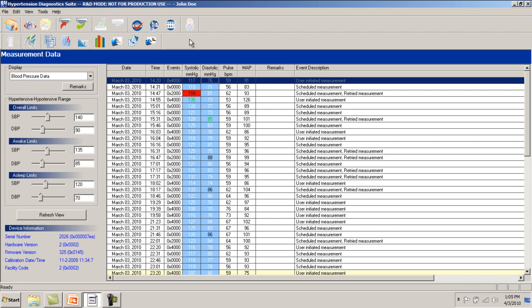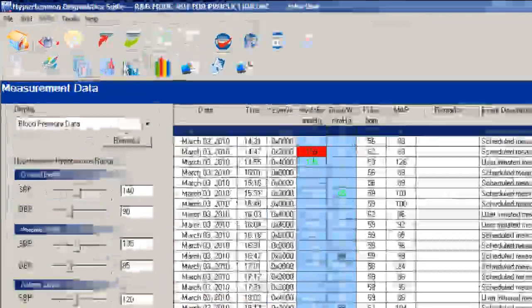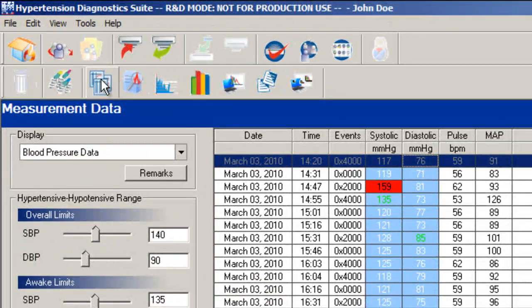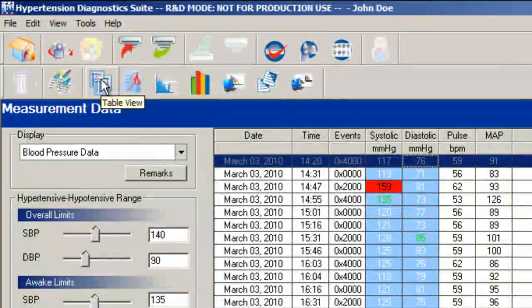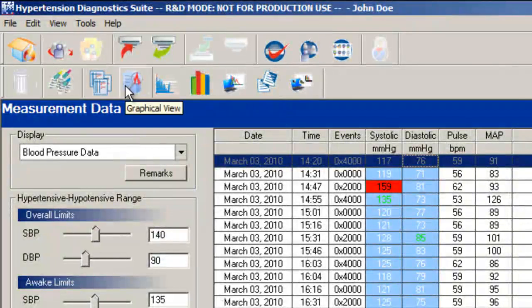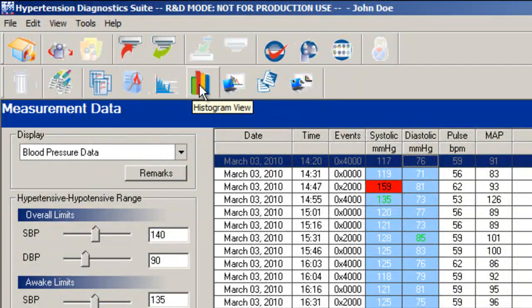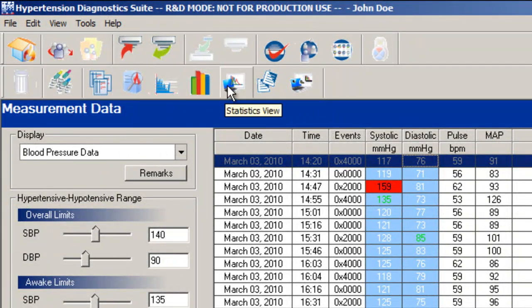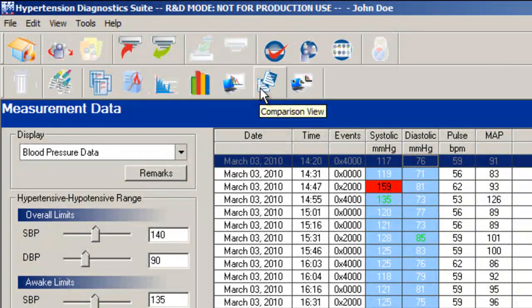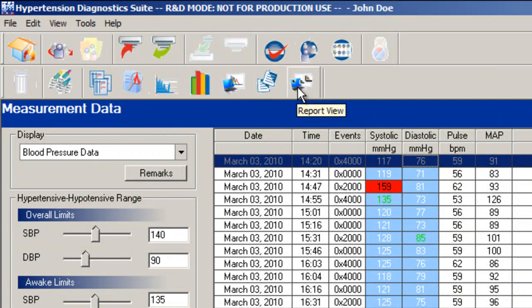Now you will see a table of measurements in front of you. You can review the table, graphical, actigraphy, histogram, statistical, comparison, and report views as needed.